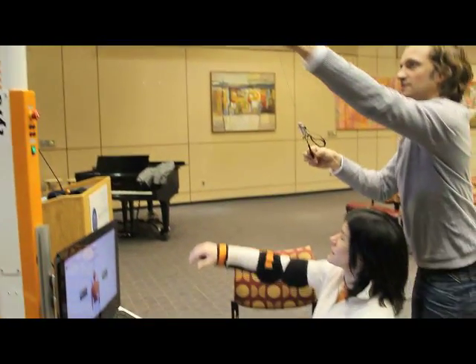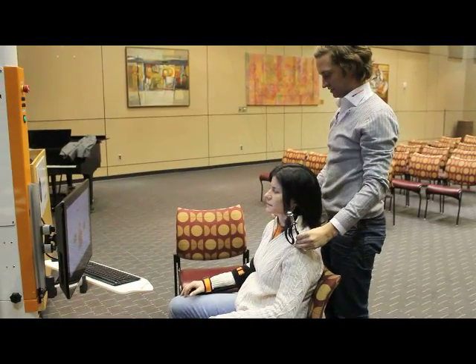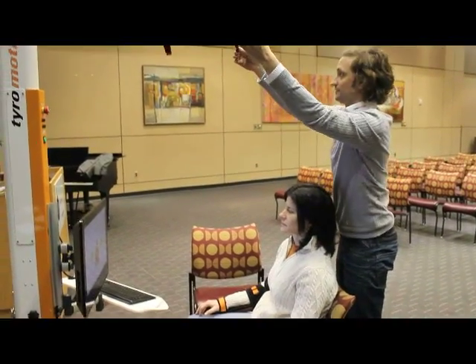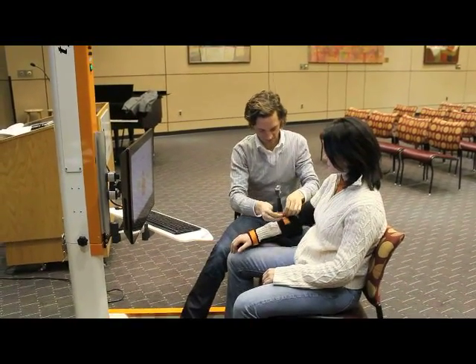Just measure your shoulder position. Keep your hands down or out? It does not matter — it's just about the shoulder position. So that's what we have to measure to get the real view.